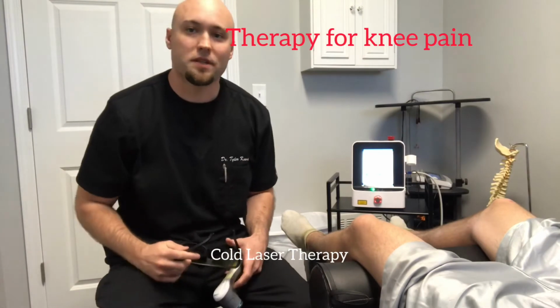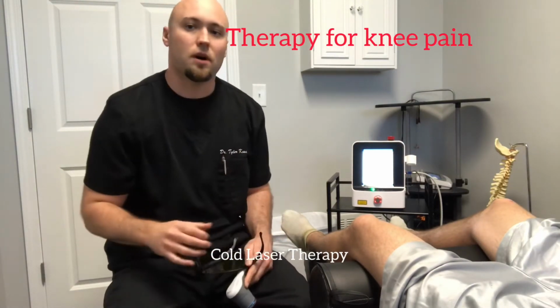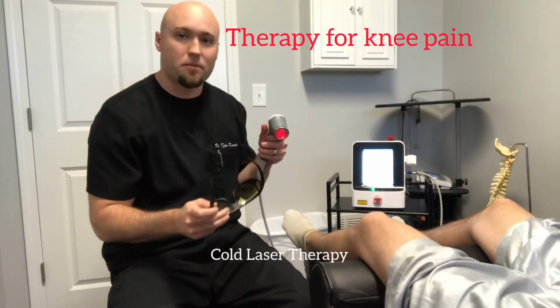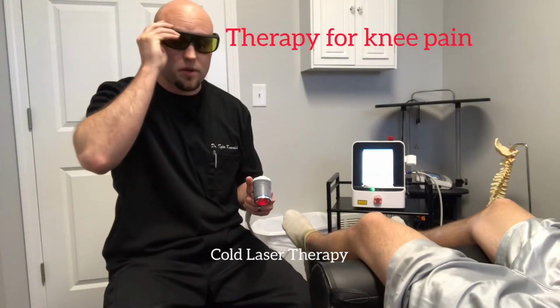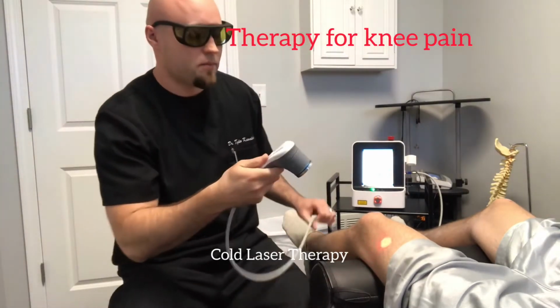Hi, it's Dr. Kowalski, and I'm just showing you another treatment we can perform to help with knee pain. So this therapy and treatment is called cold laser therapy. What we usually do is turn it on, get it going here, and we always want to make sure we put protective eye wear on to protect our eyes from the laser light.